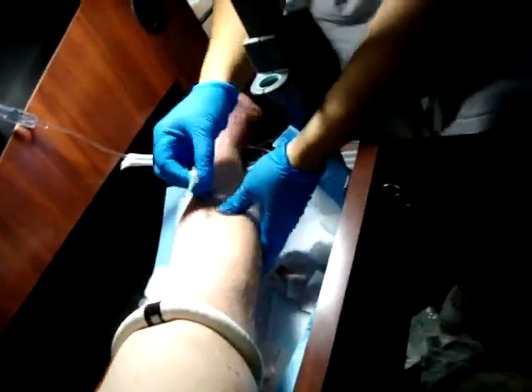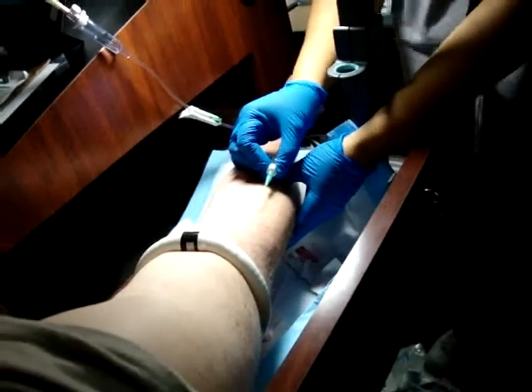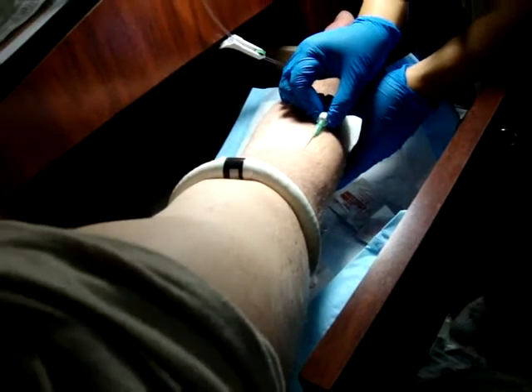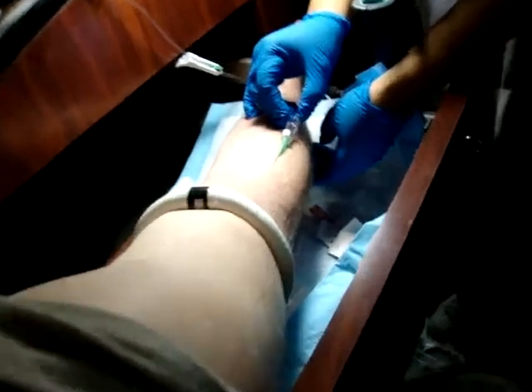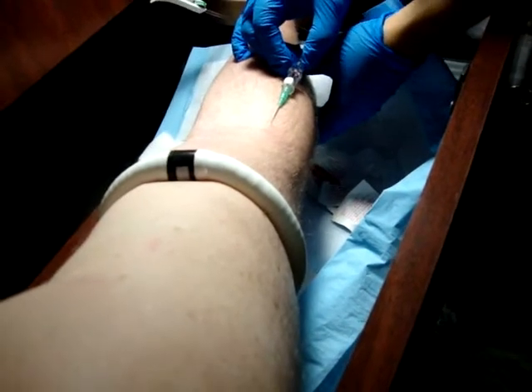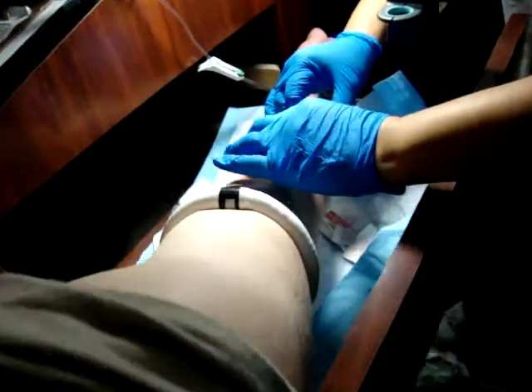You're going to pull the skin tight! You're going to go in! You see this flash? That's what you're looking for! You are going to advance it one-eighth of an inch. Now, you are going to thread it in.